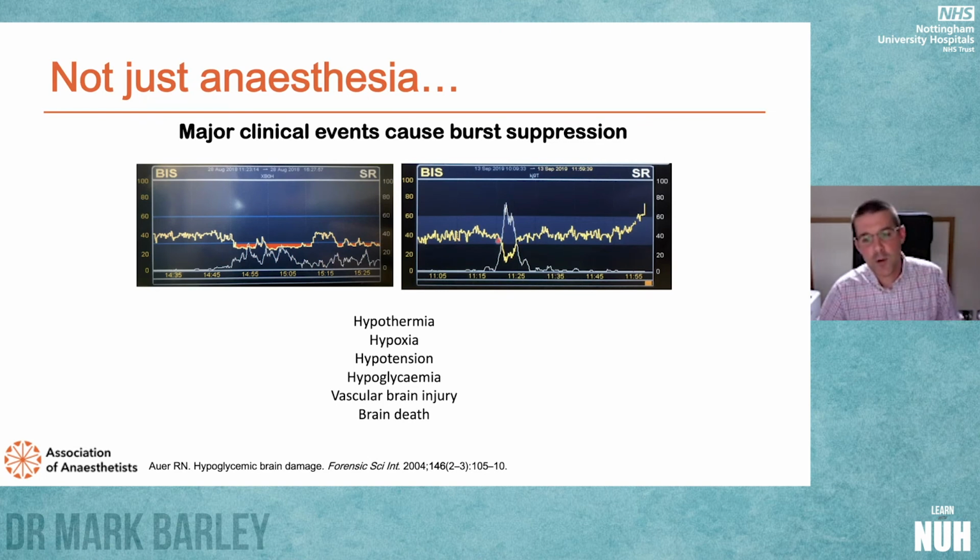This is transient hypoxemia during a case, during an intraoperative emergency, where the patient became desaturated down to around about 30%, and we see the BIS value fall, the suppression ratio increases, and when the scenario is promptly addressed and managed, everything's back to normal and the patient was successfully extubated at the end.